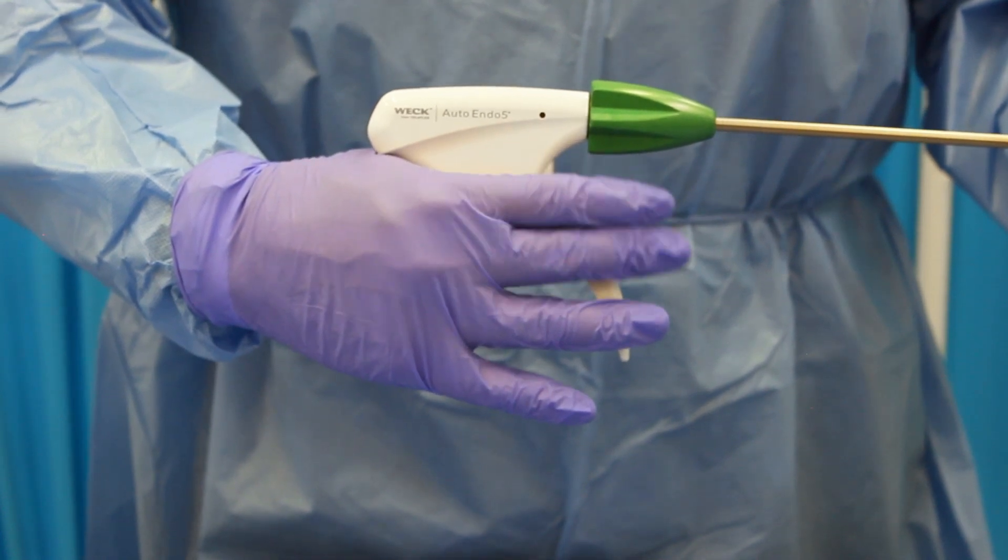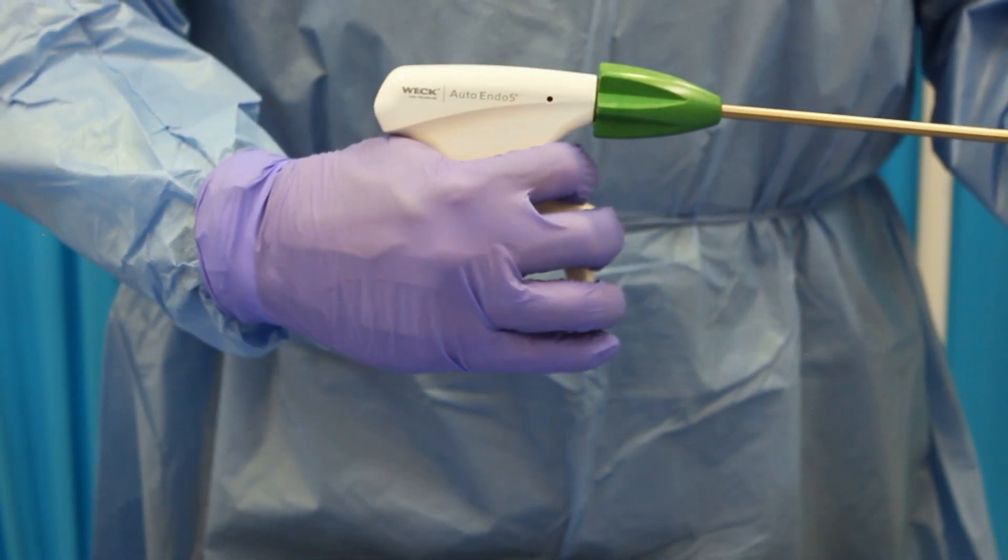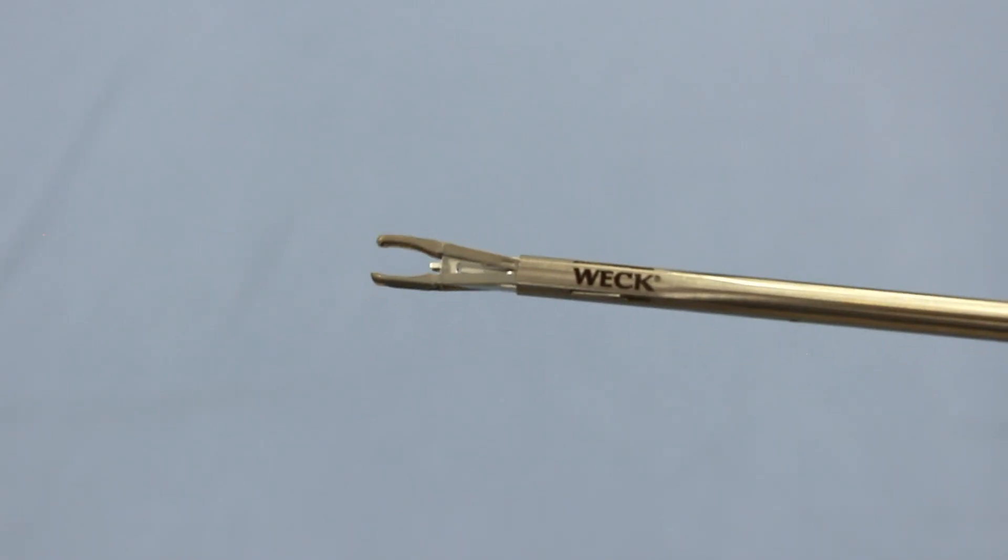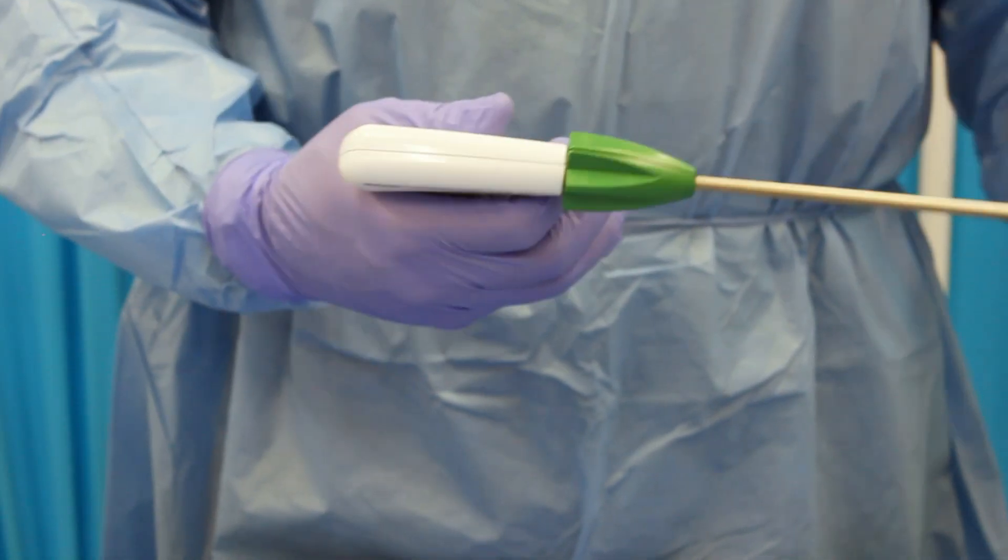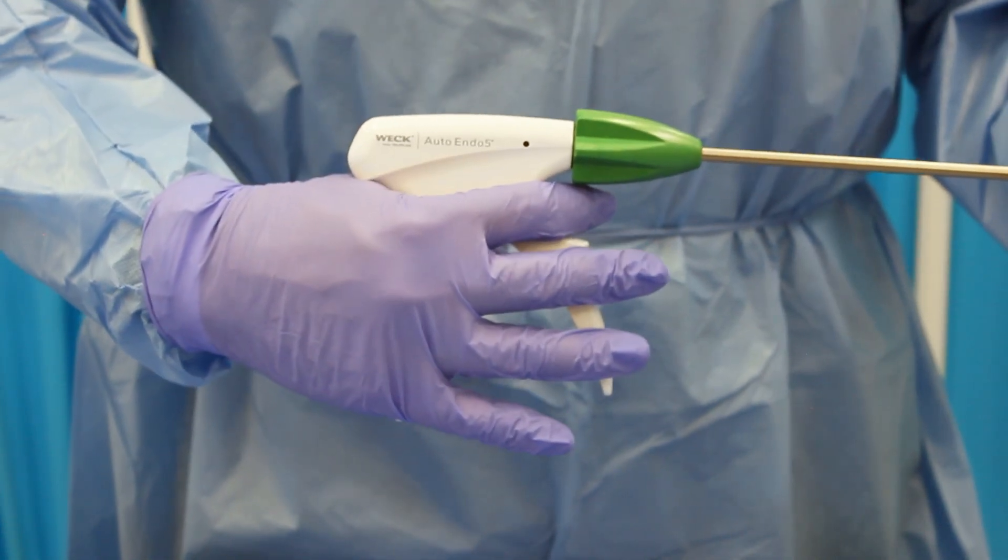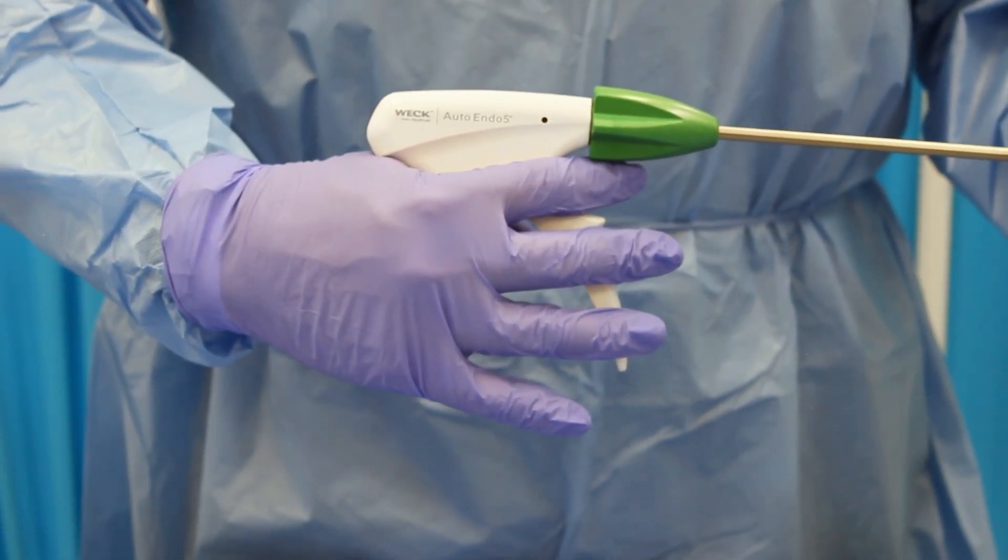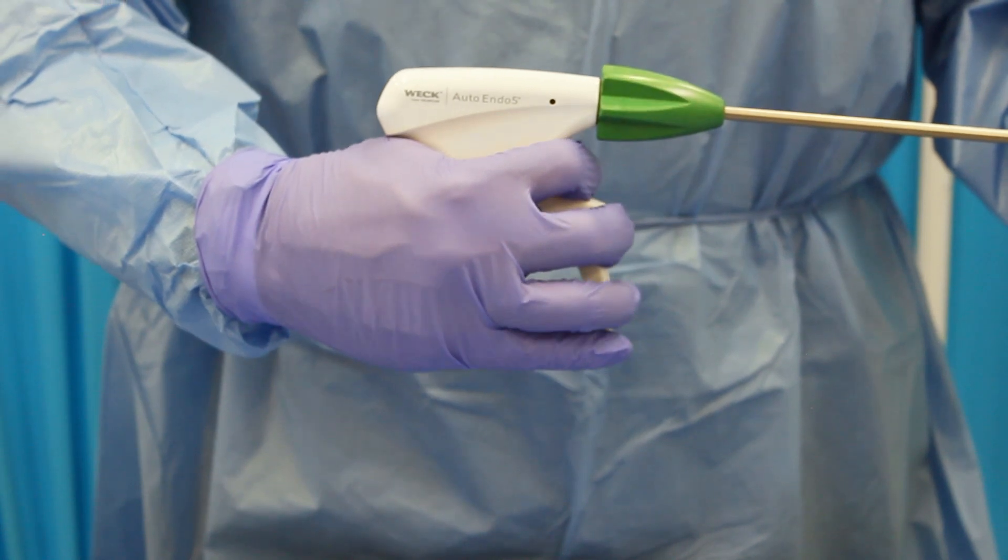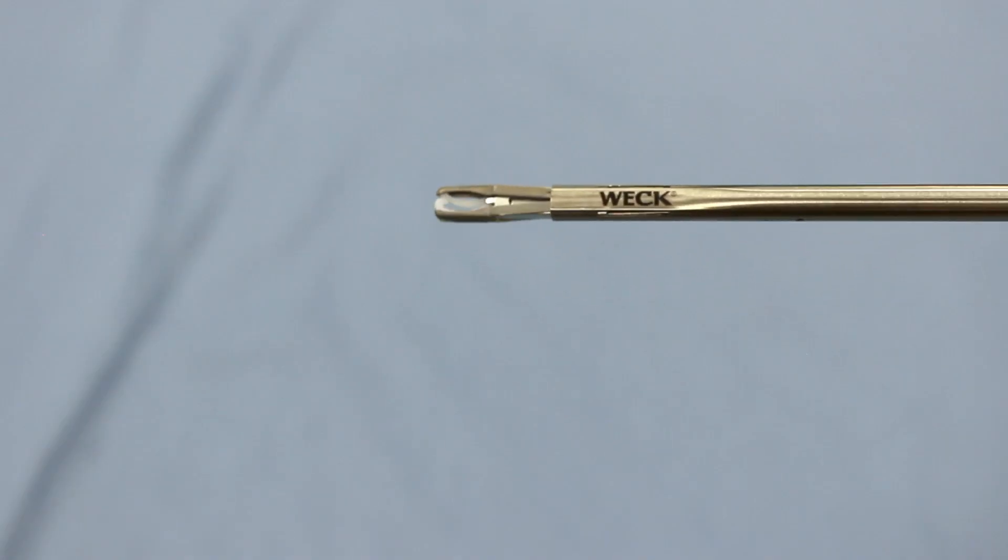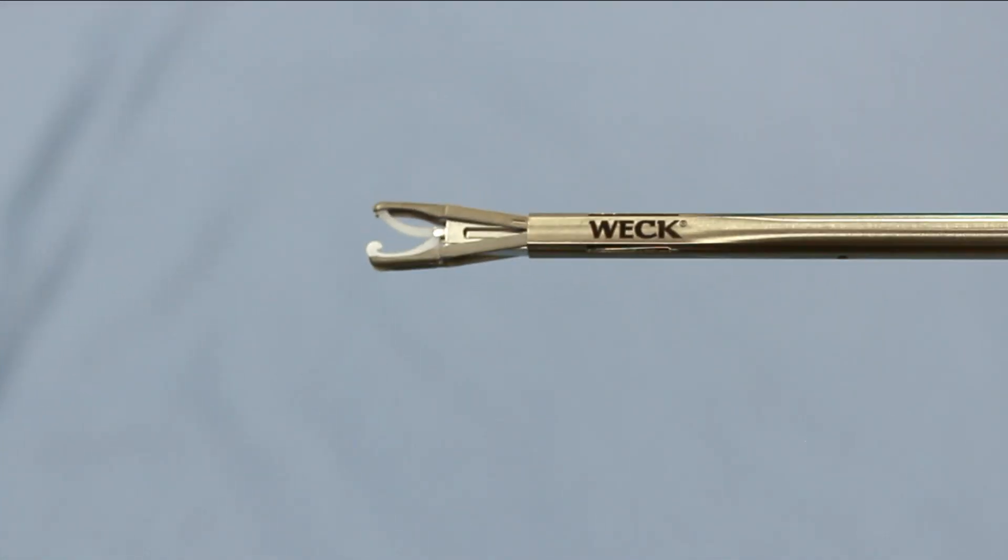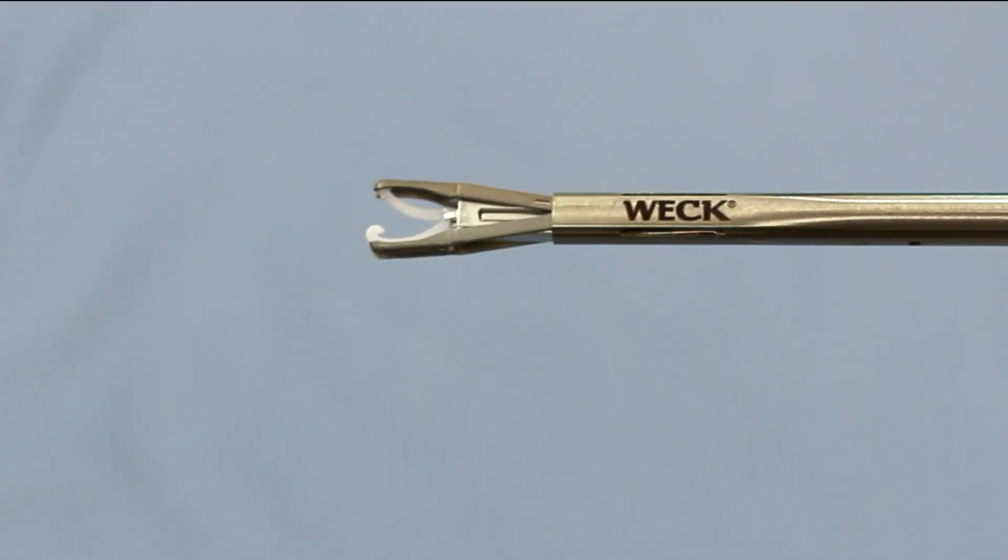Step 2: Load the first clip into the jaws by squeezing the trigger towards the handle. The ratcheting trigger provides distinct tactile and auditory feedback during the loading and firing process. When loading a clip into the jaws, the device will make a series of soft clicks culminating in a final, louder click, which indicates that the clip is loaded in the jaws at full aperture. Visually confirm that the clip is positioned in the jaws. The applier jaws are designed with three points of contact to provide clip stability, preventing unwanted clip movement when ligating.